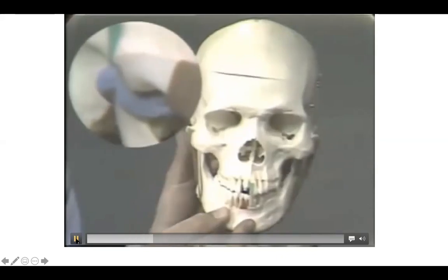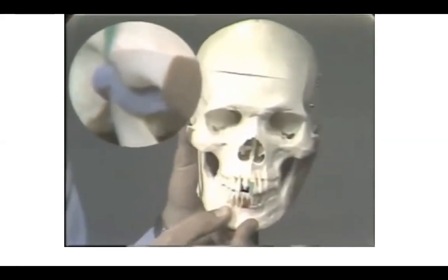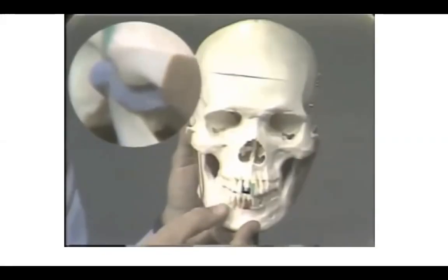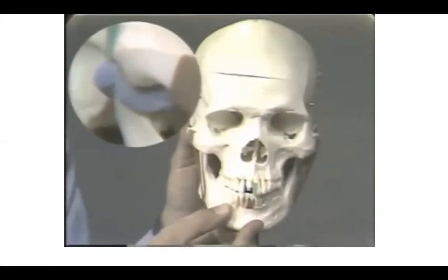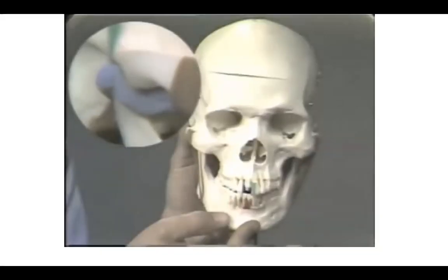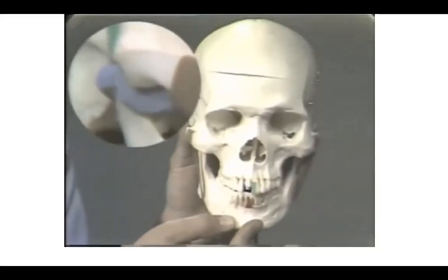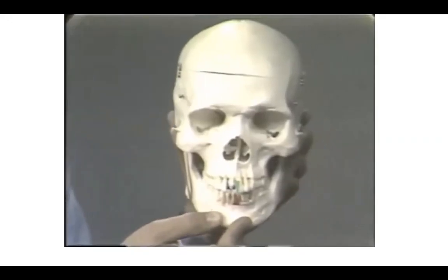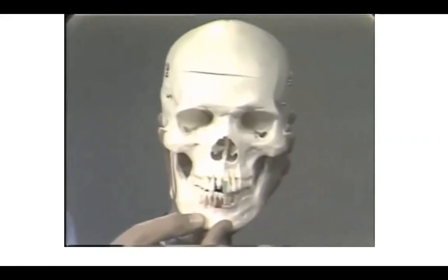And the side to which the mandible is moving is called the working side, or that would simulate a chewing side. So this is the working side, the right side. When the teeth are in the working relationship, it is the buccal cusp of the lowers in line with the buccal cusp of the uppers. The opposite side, the left side, would then be termed the balancing side.